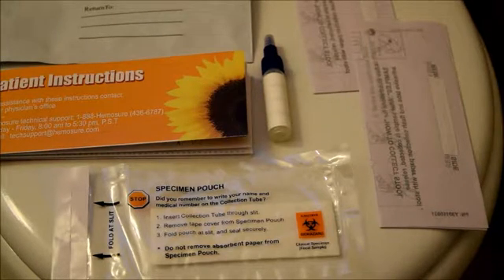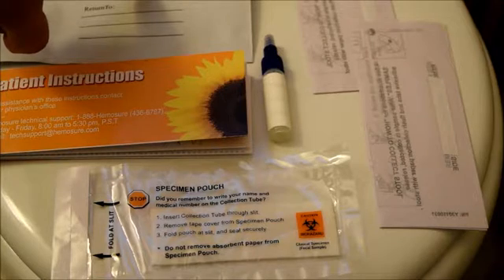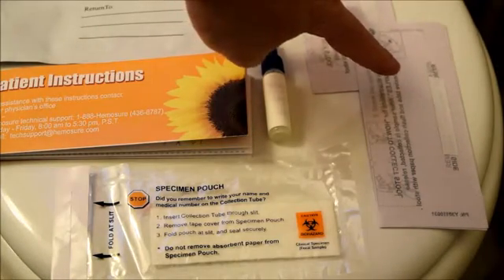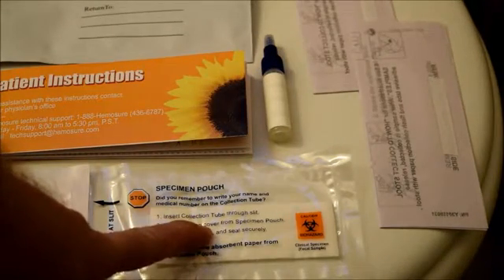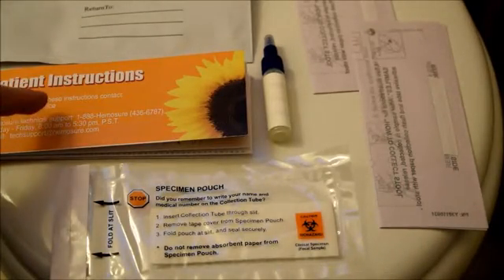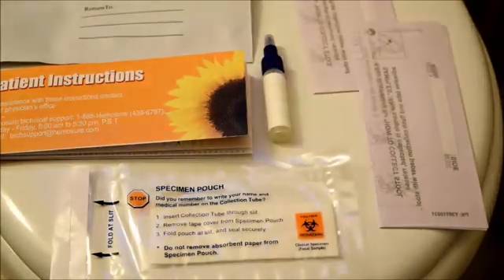Let's go over the contents of the pouch that you've been given by your physician or the lab. This is your return mail pouch in case you must mail the sample back to your physician or lab instead of returning it in person. These are 2 flushable tissue papers that you're going to use to collect your sample. This is a biohazard specimen pouch that you will put the collection tube into after you've collected the sample. You have instructions which are in English and Spanish, and finally you have your collection tube.